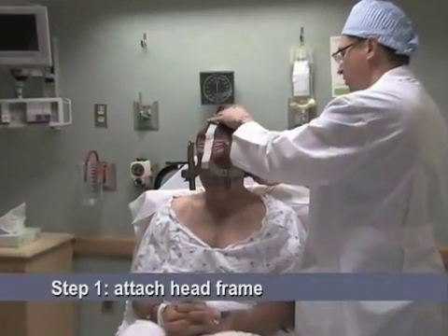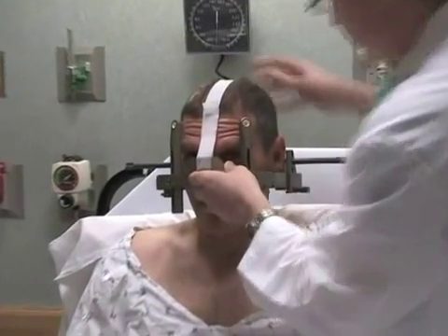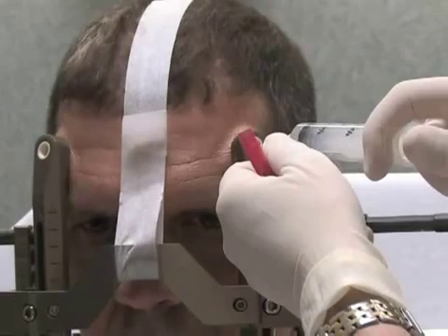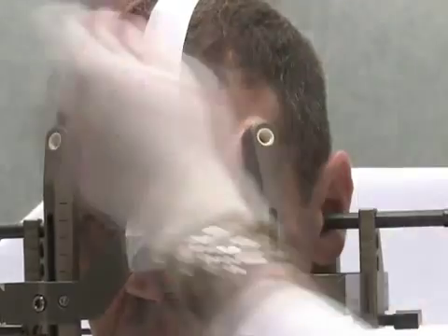The first step is to attach a stereotactic frame. Velcro straps are used to position the frame on your head. The four pin sites are injected with local anesthetic to minimize any discomfort.